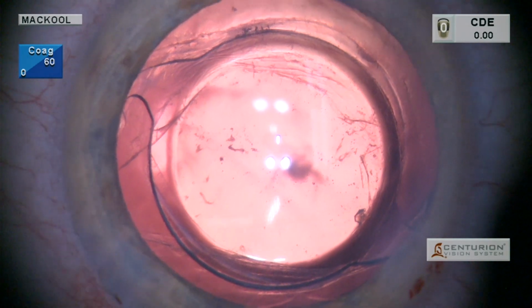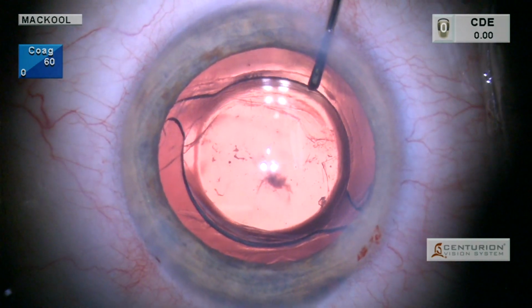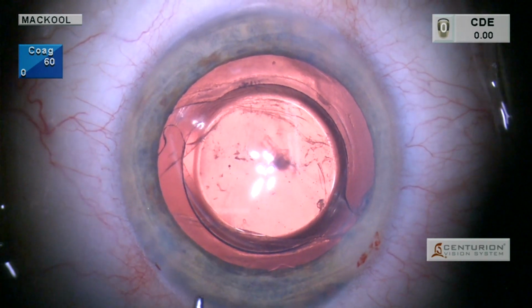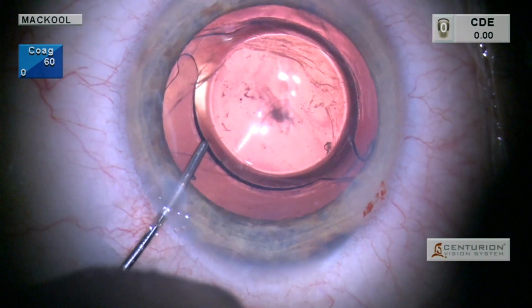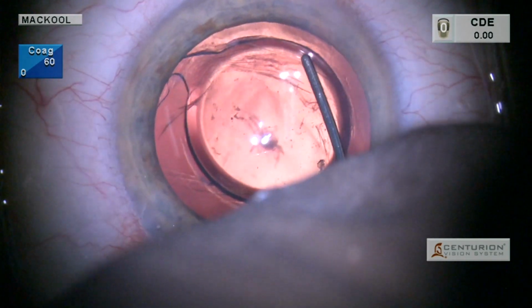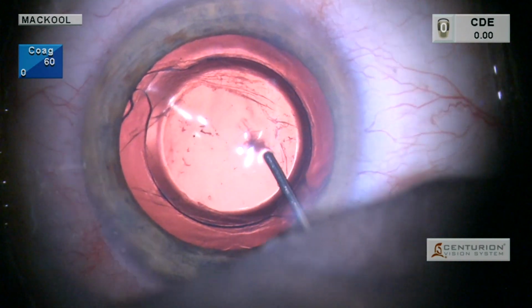And now it appears to have been prolapsed, and I've got a spatula underneath elevating the entire optic so that now the entire optic, except at the haptic optic attachments, is anterior. Now of course we want to be sure it's going to stay there. So looking at it here, want to one more time go in with the spatula here and verify that this capsule on this side is underneath the optic. The same thing on the proximal side here.